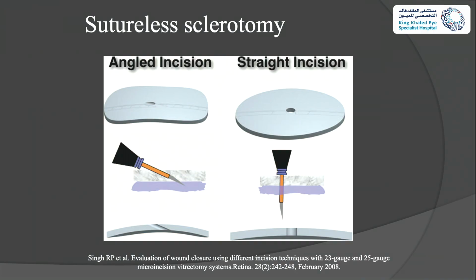So another note: when you approach the sclera to do the sclerotomy, there are obviously a couple of ways to insert the trocar. One is to go straight in, vertically, and the other, which I just showed you, is at an angle. I've also seen people try to do it in so-called two steps. You go in at an angle and then turn and go in. In reality, you're actually creating an angled incision, and the turn is only to bring the trocar into the vertical position so that you can insert it properly.